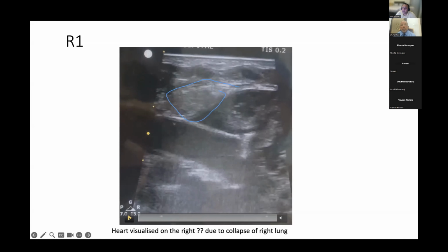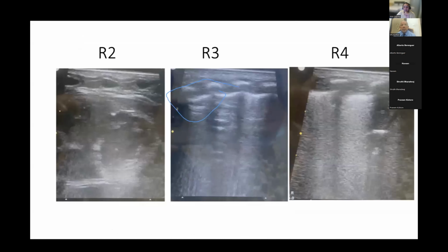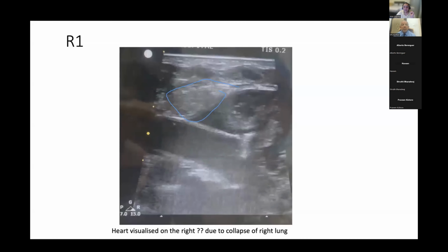I would like to see if there is any obstruction of the right main bronchus that might collapse the lung and pull the heart to the right as well. Yeah, lovely. I'm going to open it up to the audience now. Any other? If the baby is completely asymptomatic, nothing wrong. And dextrocardia. Very good. Amazing. Dextrocardia. So those are 4 differentials that are very important if you see a significant amount of heart on the right side. Well done. You guys are absolutely amazing.